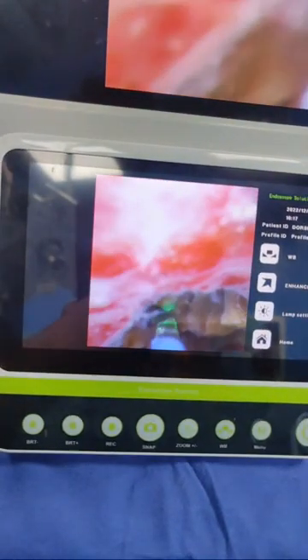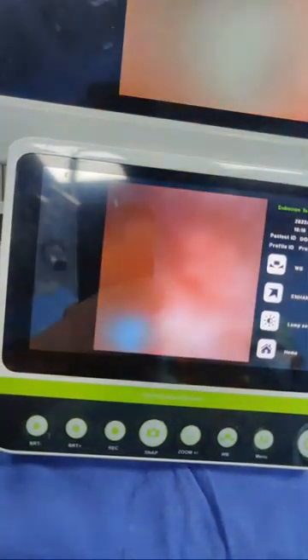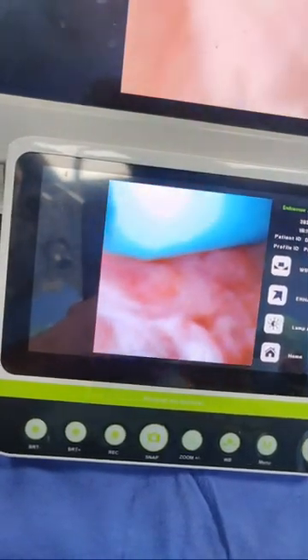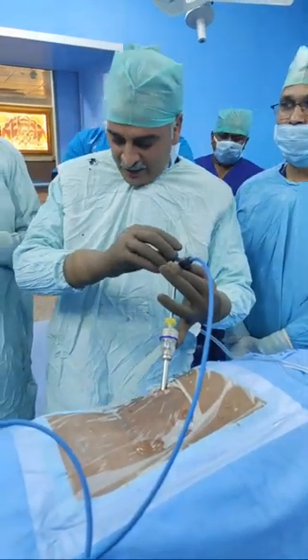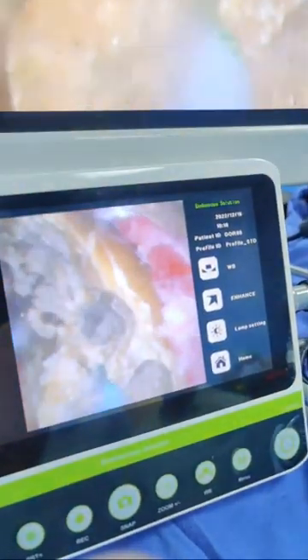Shivram ji, bring this stand a little closer. Orientation is strong if you put it at 12 o'clock. So this is again a very important thing. If you put this at 12 o'clock, then your orientation is better, because this nephroscope had moved, so the orientation was getting disturbed.